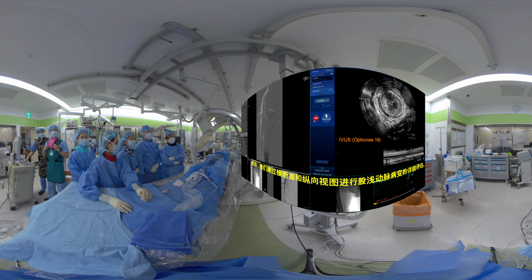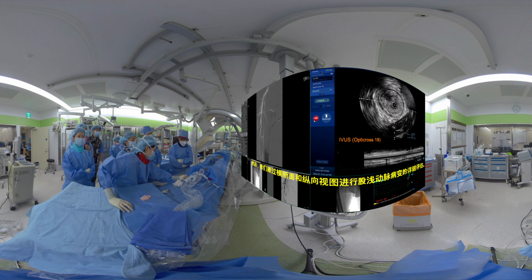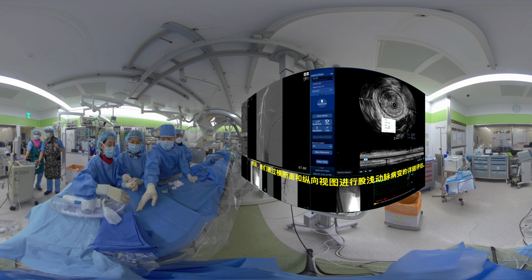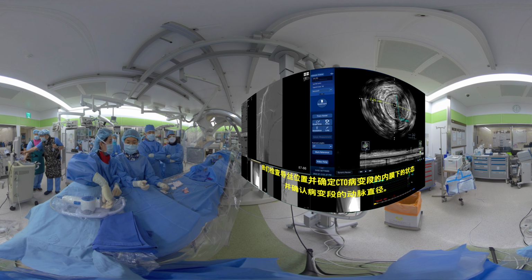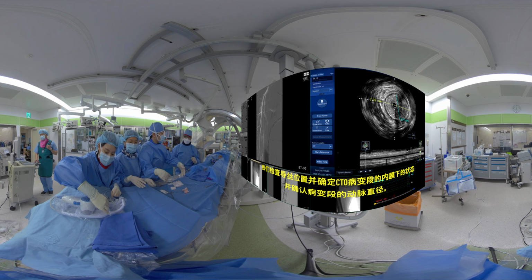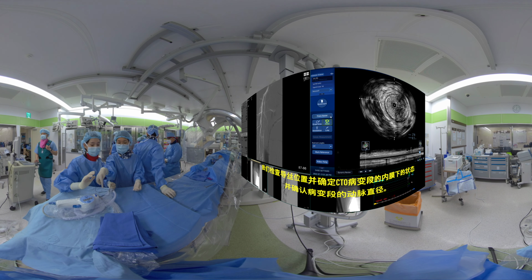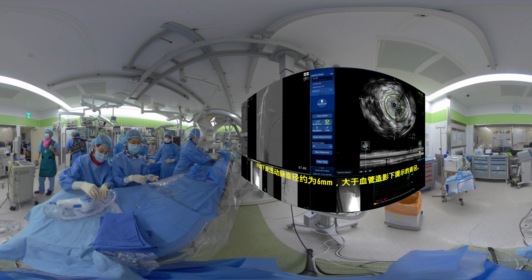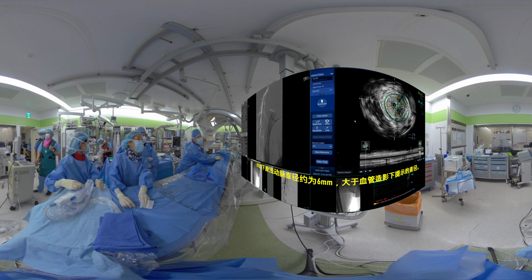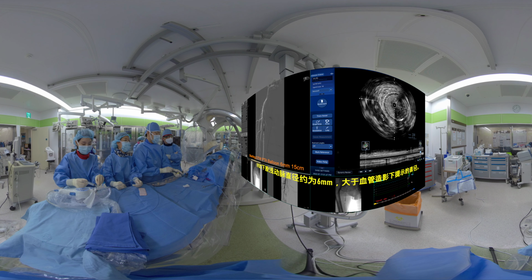And then we evaluated the SFA lesions with transverse and longitudinal views carefully. We checked the wire location to confirm the subintimal status and the diameter of the artery along the CTO lesions. The diameter of the SFA was around 6 millimeters, which was larger than the diameter from the angiogram.